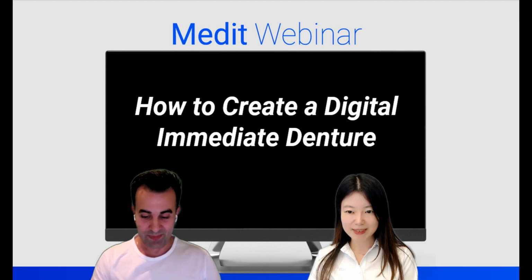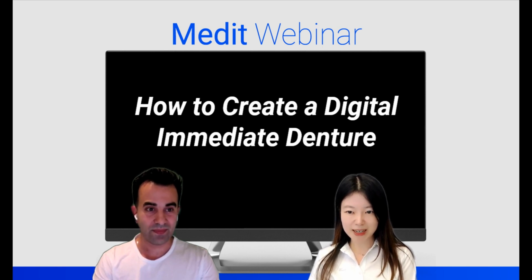Yes, today's is an exciting webinar. We're going to be talking about the digital immediate denture workflow. So everyone must be so interested in this topic, immediate denture. Can you introduce a little bit about it?